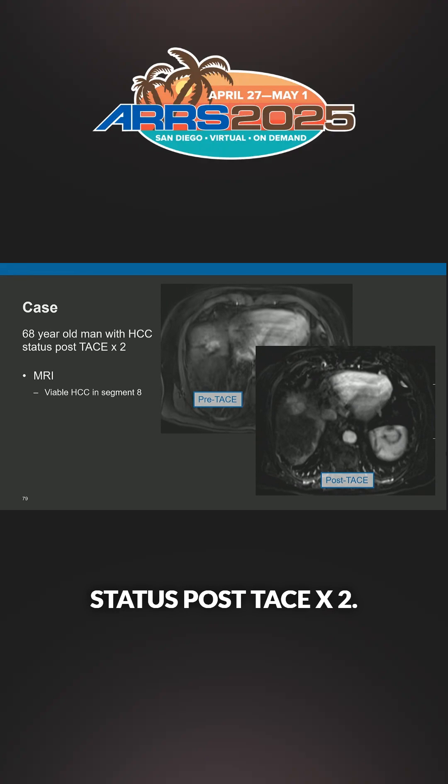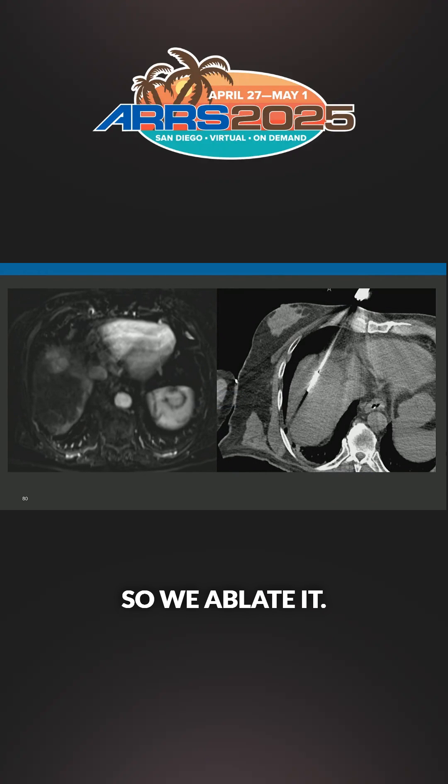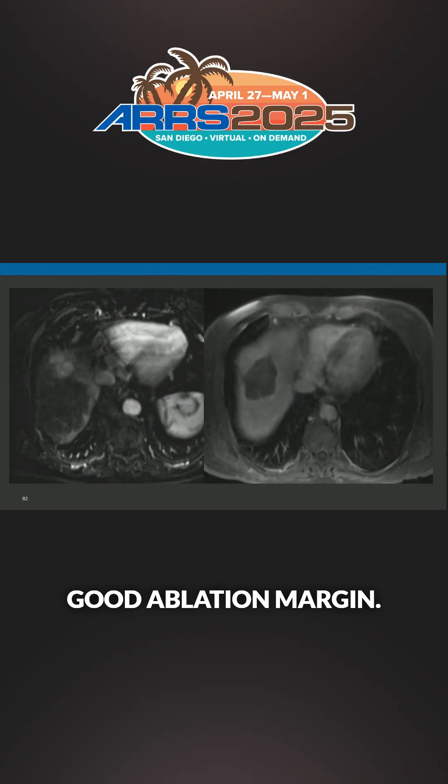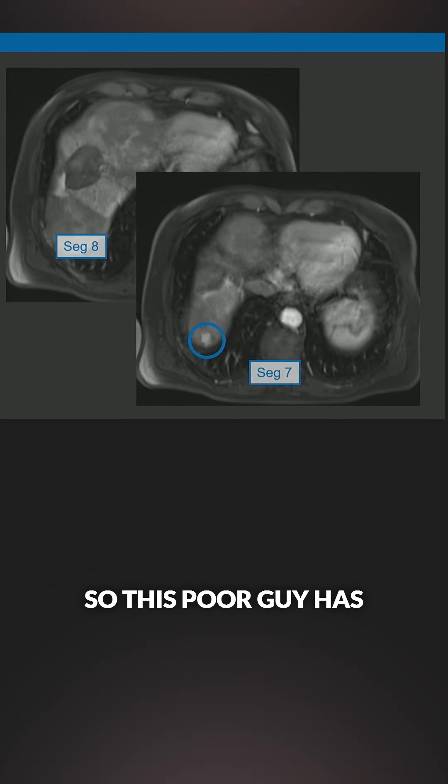68-year-old man with HCC, status post ablation times two. He has residual disease, so we ablate it. Good ablation margin. This poor guy now has another HCC back in segment seven — segment eight looks good.